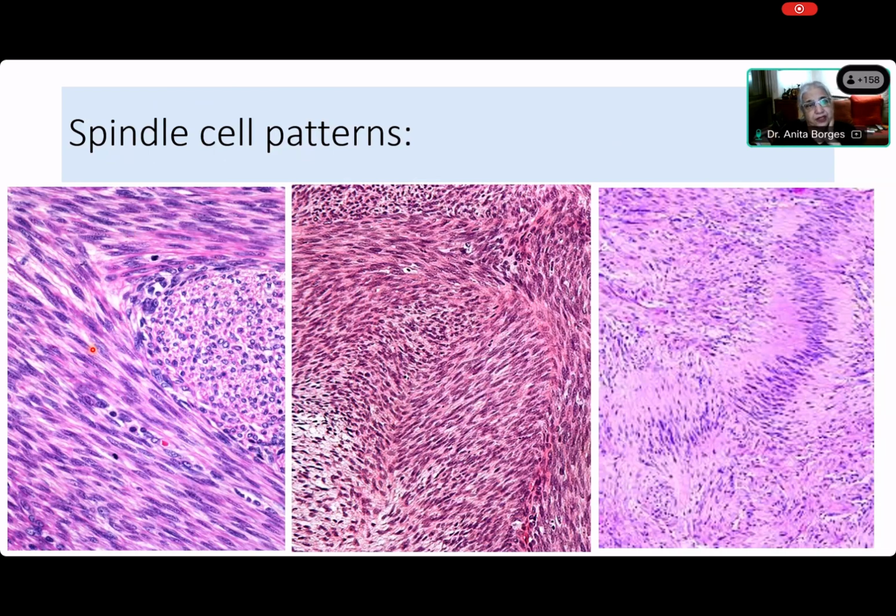The definition of a fascicle is you see spindle cells, and you can see them all here, all running together as a bundle. Here that bundle has been cut transversely, but otherwise they're all running in a bundle parallel to one another, and each of them is running parallel to the direction in which that bundle is running. So if I have to show it to you, here you are. This is the direction, where you see that big black arrow, in which that bundle is running. You could say it is running in the opposite direction, it doesn't matter, but the bundle is there, and you can see that all these cells are spindle cells.